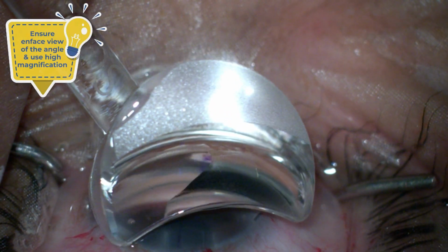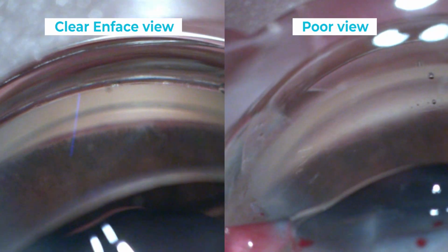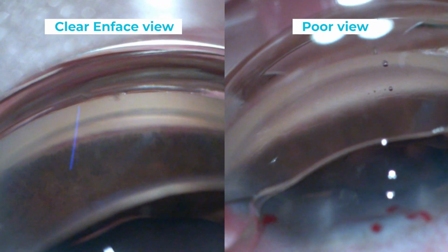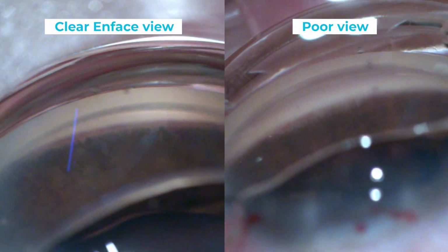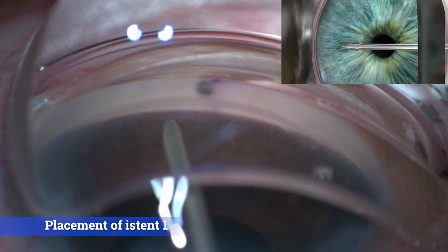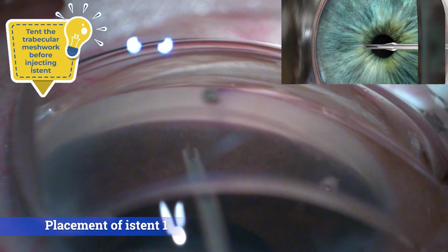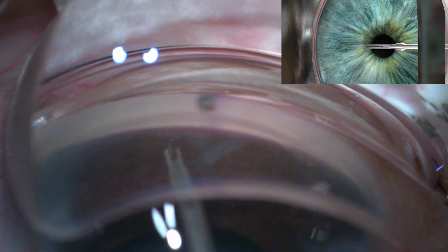After changing the position as described earlier, the gonio lens is placed over cornea to visualize the angle structure. The injector is then inserted through the main incision. The sleeve is retracted as one reaches close to the angle.